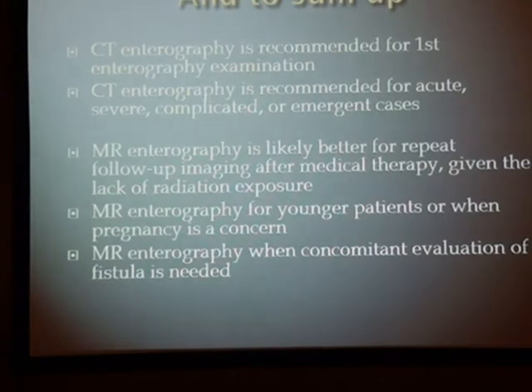To sum up, CT enterography is recommended for the first enterography examination. CT enterography is recommended for acute, severe, complicated, or emergent cases. MR enterography is likely better for repeat follow-up examinations after medical therapy, given the lack of radiation exposure. MR enterography is also advised for younger patients or when pregnancy is a concern. MR enterography is also needed when concomitant evaluation of fistulas is required.